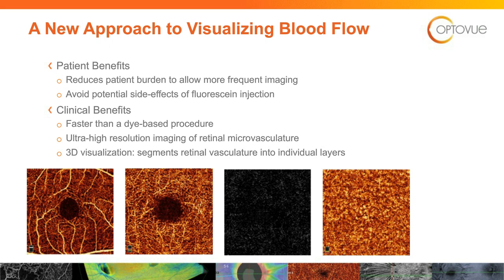If you're not familiar with en-face images, take a look at those 4 images on the bottom. Those are really 4 different slabs through the retina, going deeper, deeper, deeper with each individual slab. On the left side, starting with the superficial capillaries. On the right side, going down into the choriocapillaris. And again, we'll go through this in a little bit. But familiarize yourself with en-face imaging, those different segmentation slabs as you'd like to call them, going through that different interpretation with OCT angiography.